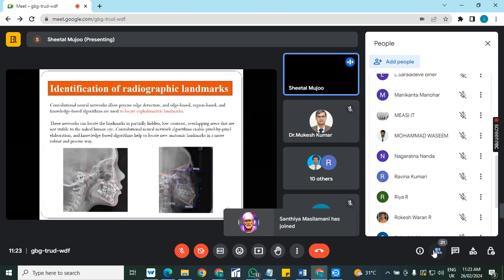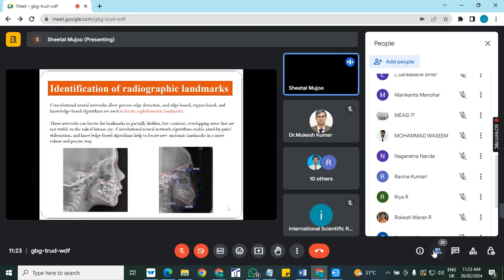Now we'll first discuss perio for the bone loss. Everything, you have its application in each and every field. So first thing, let's discuss orthodontics. You know that in orthodontics, they take a lateral ceph and then they try to do the analysis.